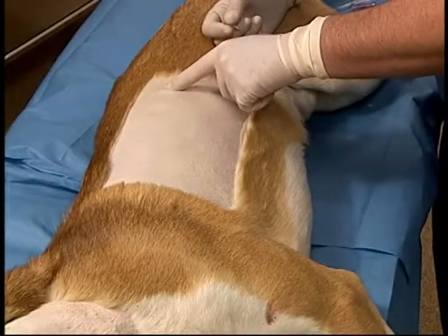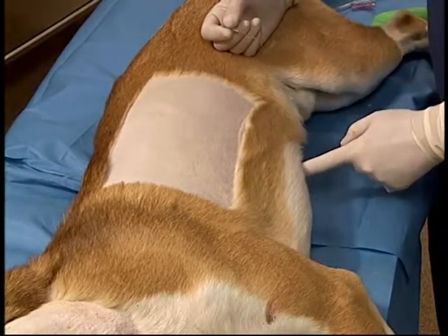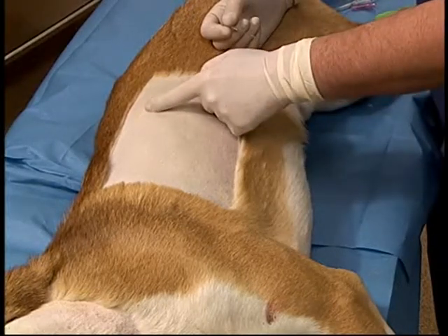Thoracentesis is performed at the seventh to ninth intercostal space. Ideally this should be counted, but in an emergent situation an imaginary line can be drawn from the xiphoid directly dorsally.